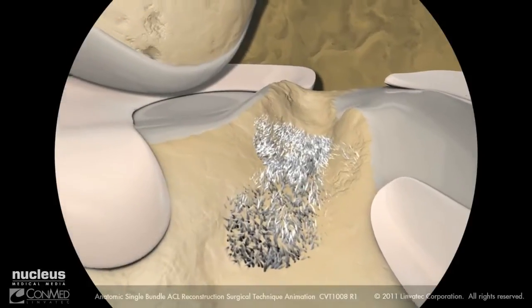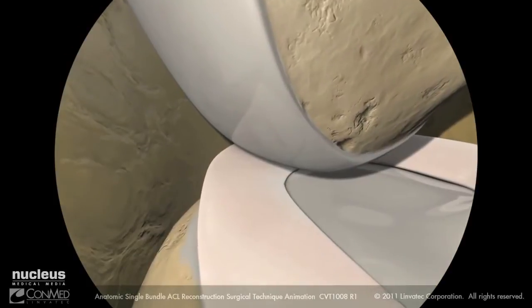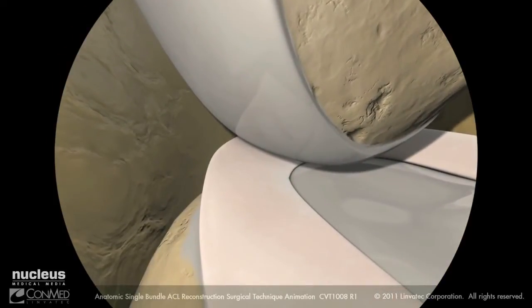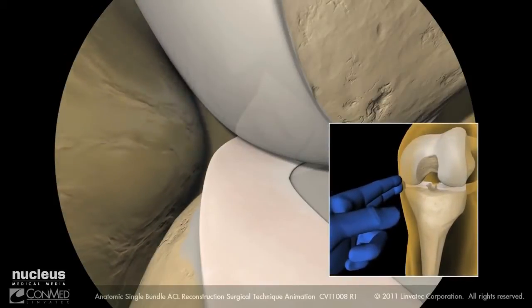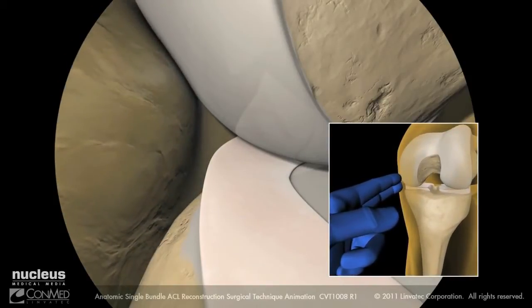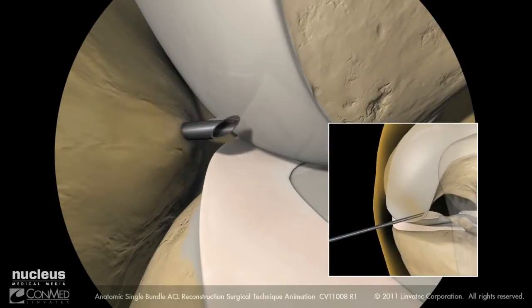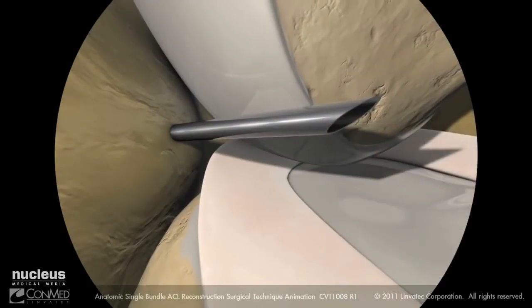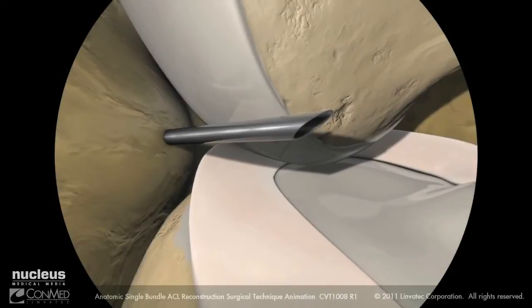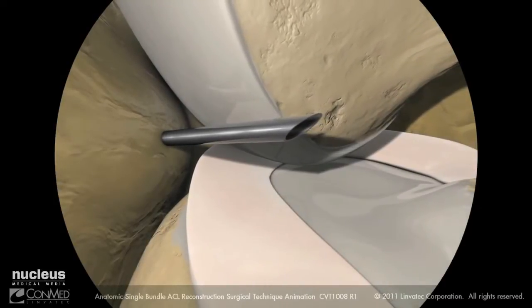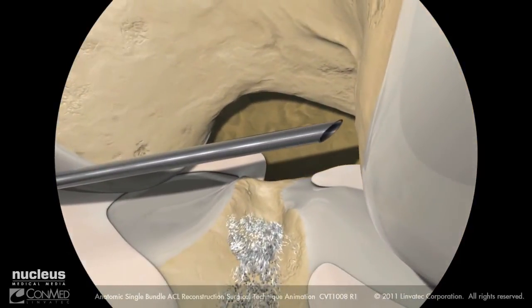Creation of the accessory anteromedial portal is made under direct visualization with the arthroscope placed in the anterolateral portal looking medially. With the knee flexed at 90 degrees, palpate the medial joint line. Under direct visualization, insert a needle just anterior to the medial femoral condyle directed towards the intercondylar notch. The needle should be above the medial meniscus to avoid damage. Advance the needle to confirm access to the femoral footprint of the ACL.